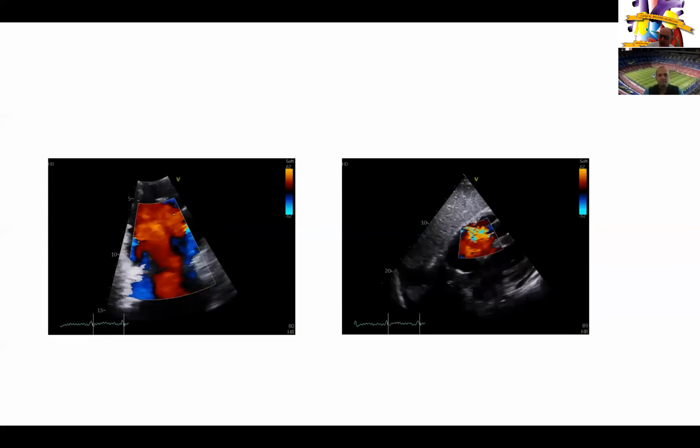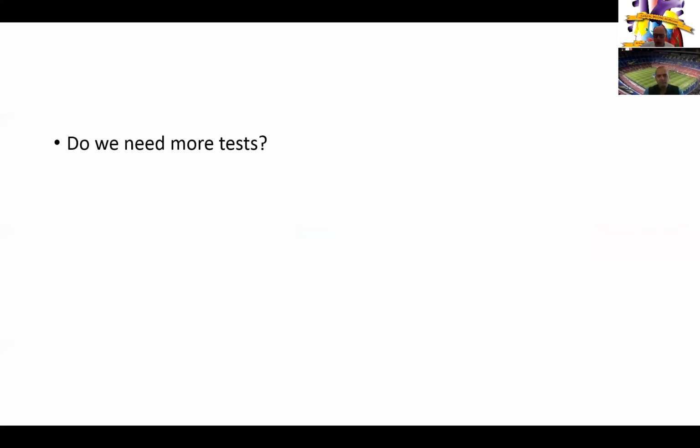Yeah. So with that in mind, what do we do next? Yeah, so there are two things we consider in patients with endocarditis. One is you could get an endocarditis CT, which we're doing more and more as we realize there are risks of transesophageal echocardiogram. But here, given the metallic valve and to get better images, I think we'd go forward with the transesophageal echo. But I was wondering, Dr. Gerber, if you could just spend 30 seconds explaining your decision process of getting a CT versus transesophageal echocardiogram.